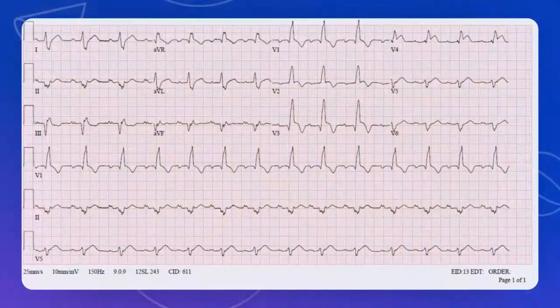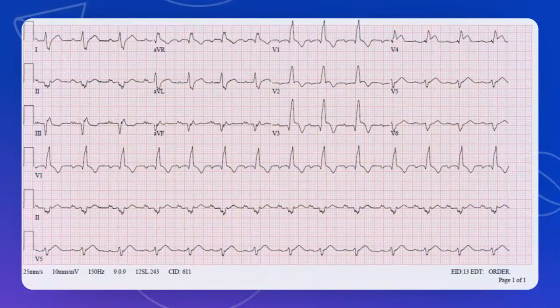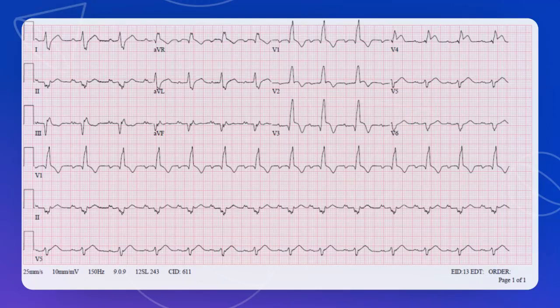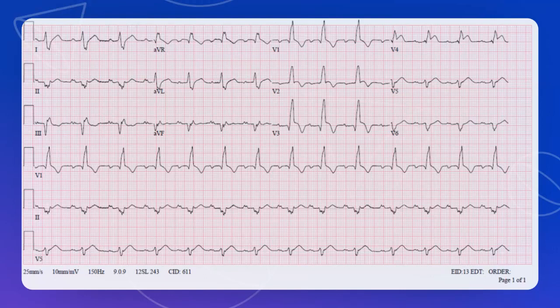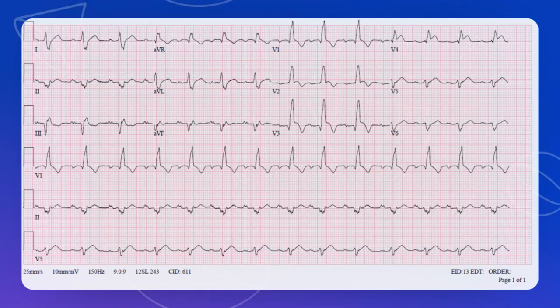On the third ECG the patient has right bundle branch block and also an anterior STEMI — look at V2, V3, V4 with anterior ST elevation. You'll treat the STEMI, but you've also got right bundle branch block. Now look at the axis: lead one is predominantly downwards — that's bad. Lead two is also predominantly downwards. We've got an extreme axis. Looking at AVR, it's upwards — that's extreme right axis deviation. Right bundle branch block plus extreme axis deviation equals bifascicular block.